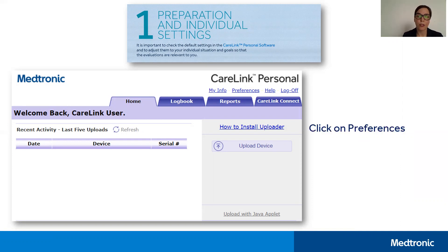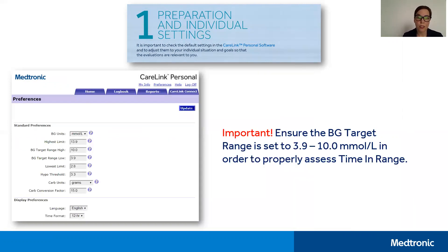Next, you'll want to click on Preferences in order to customize your CareLink reports. It is important to check the default settings in CareLink Personal software and adjust them to your individual situation and goals so that the evaluations are always relevant to you. A good example of when you might want to do this is if you're working shift work, where perhaps night shift means that your overnight period would not be typical — in that case, you'd want to adjust it to your own personalized settings.